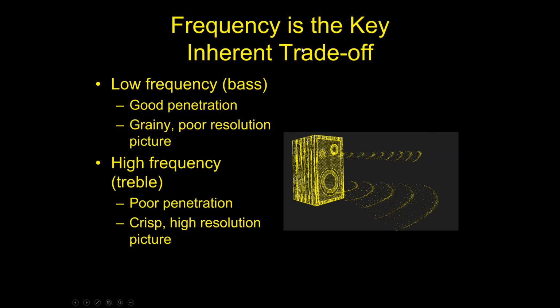Okay, we've talked about the velocity of sound, and that it's dependent on the medium in which it travels. Now we have to talk about the frequency of the sound as it comes out of the ultrasound machine. The easiest way to remember this is to look at an old-fashioned stereo speaker, which tends to have different components. If you take off the grill of one of these old speakers and look in, there's a big round part that has a large diameter, and that's called the woofer. Then you typically have a mid-range driver, and what's called a tweeter, which is the high frequency. So that's the trebles and the cymbals and the piccolos and all that kind of stuff.